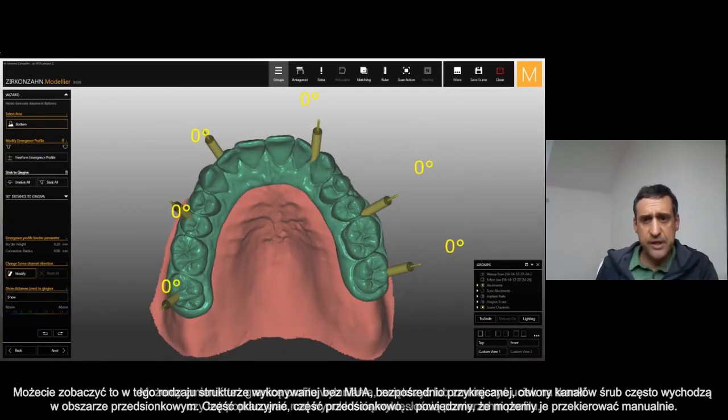You can see that this kind of restoration without any multi-unit — directly with the connection to the implant — the holes are coming from the vestibular area. Most of the framework, just this one implant is more or less occlusal. The rest are all out.